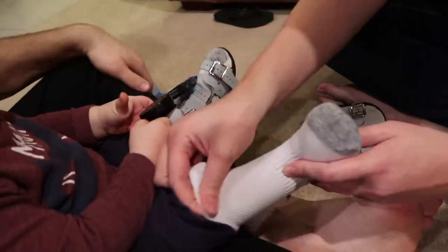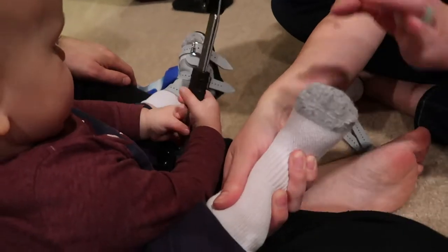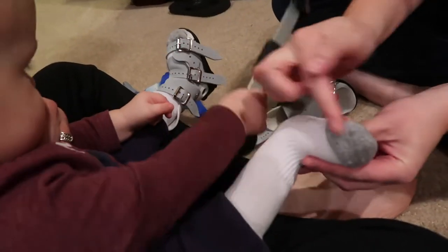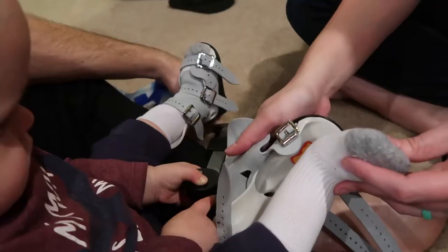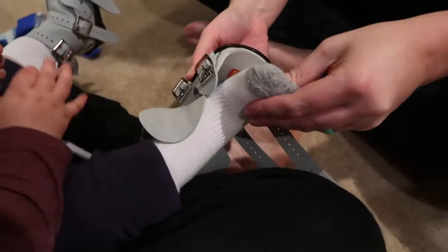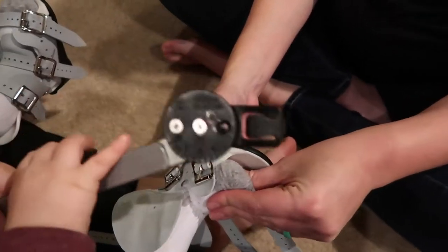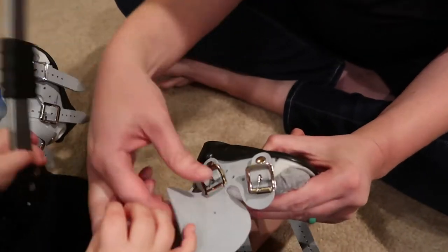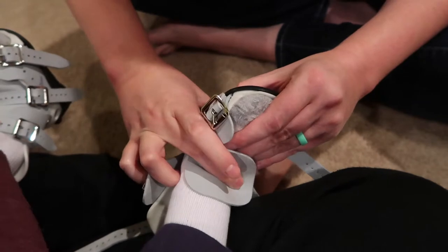Another way to do it — the way the doctor showed us — is from a different position. You can have him laying down or sitting in someone else's lap. You use his knee to push, so you have his knee at a right angle and his foot here, which puts his foot automatically in the right position. Then you take the boot in the other hand, scoop his heel, and slide it down until it's in the back, holding his foot in that position while putting pressure to keep it back. Then fold the tongue across.